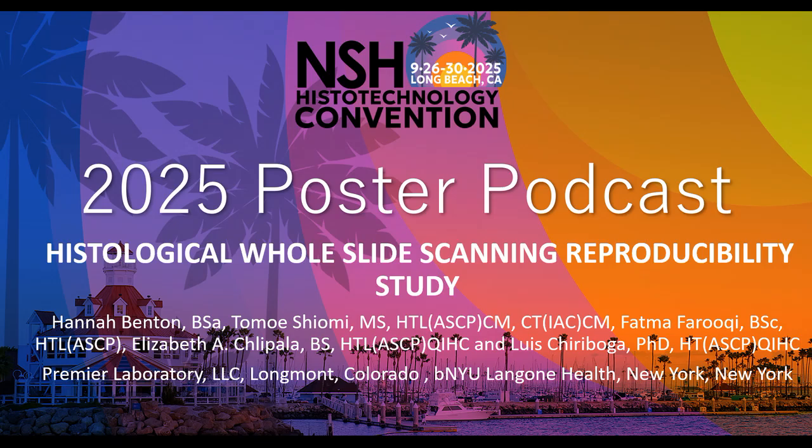If people are implementing an image analysis solution, especially if they're running that solution across multiple staining runs, multiple slides, and things like that, they need to make sure that the staining, which is part of all that pre-analytics, and the analytics remain in control, or within a range that the image analysis algorithm is robust enough to manage. So it plays to how important it is to have stain quality and stain reproducibility over a very long period of time. And I just want to add on to that.